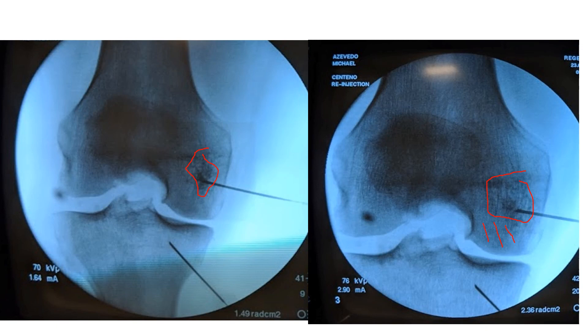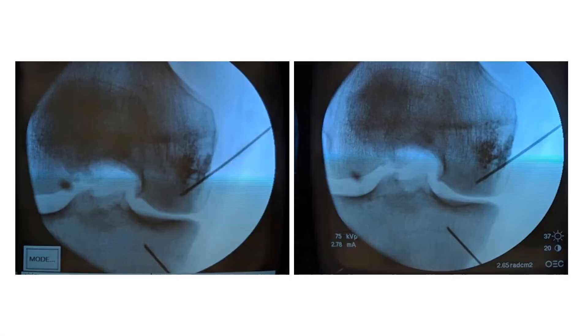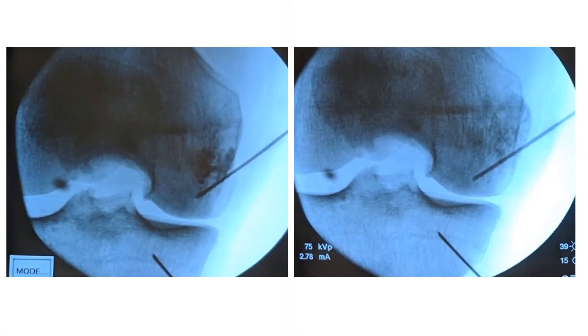Regardless of how much volume I put in here, I can't get that to change. So I redirect my needle — now my microtrochar is going down — and you would think I'd start to get the orthobiologic to flow in that area. But when I inject, it goes right back up to this area; it doesn't go where I want it. I go a little deeper and redirect again, and it's still going right here. In fact, I've injected so much volume that you can even see the contrast going outside the bone, primarily because it's now going into the vasculature outside the bone that connects in with the bone marrow space. Regardless of how much I tried, I was not able to get material to go right here where I wanted it.